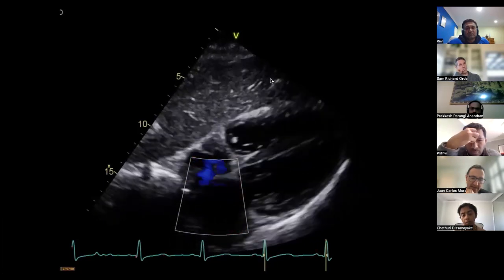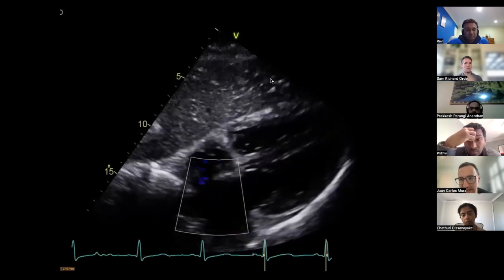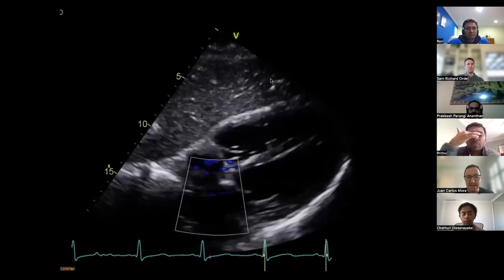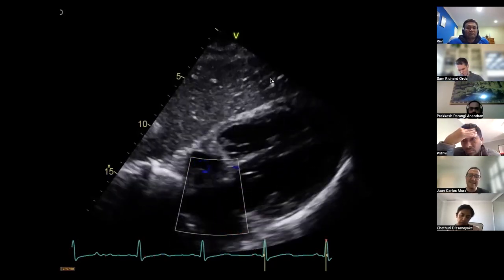So give me your conclusion. Sorry. So give me your conclusion. So put it all together. This was the last image. So put it all together for me. Right.